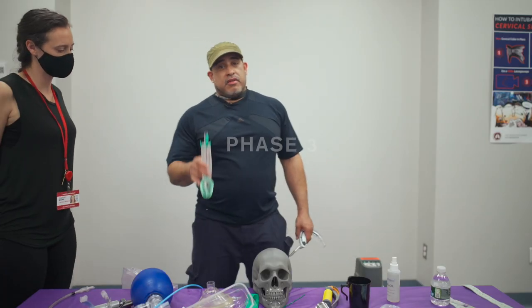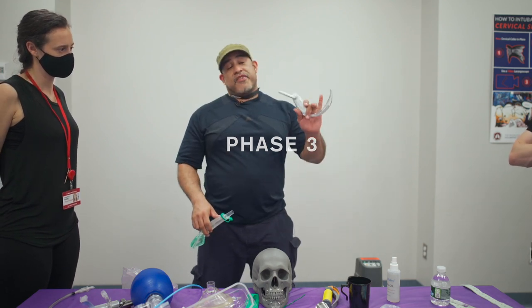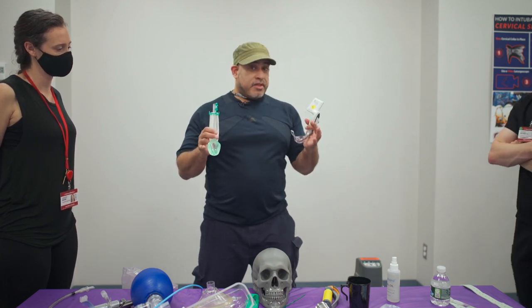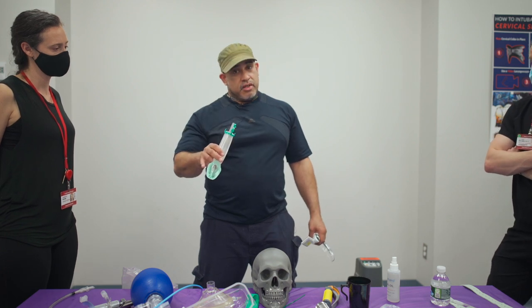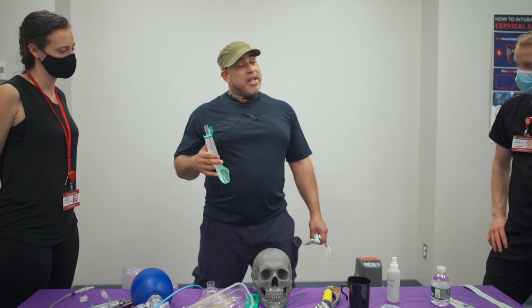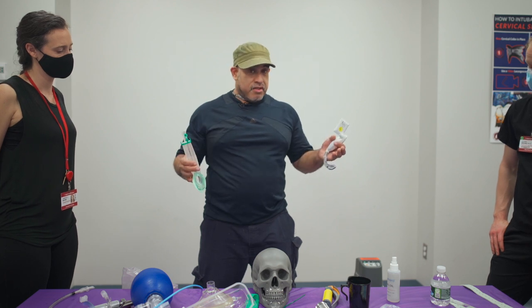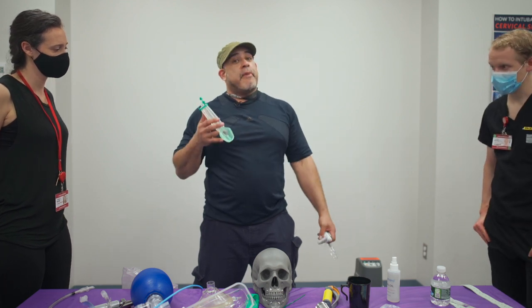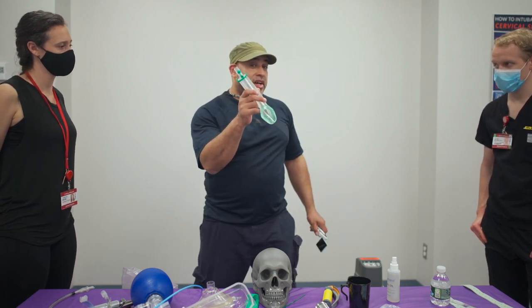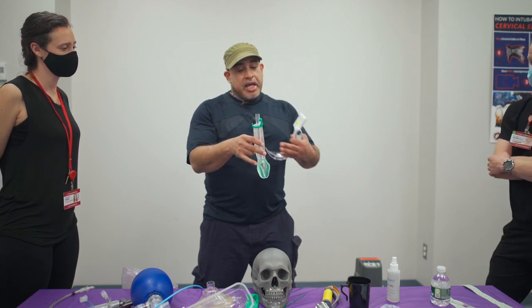So the last part takes undoing what's been done for a long time, which is emphasizing intubation over putting in a supraglottic airway. Both of them are advanced airways, but we have to check our egos, especially with resources. If I'm the only one managing the airway, poor circulation, a cardiac arrest, a very sick patient, and I don't have the staff, I have to maximize my time. This may take a while to get the tube in, but putting in a device like this, I don't have to interrupt CPR.